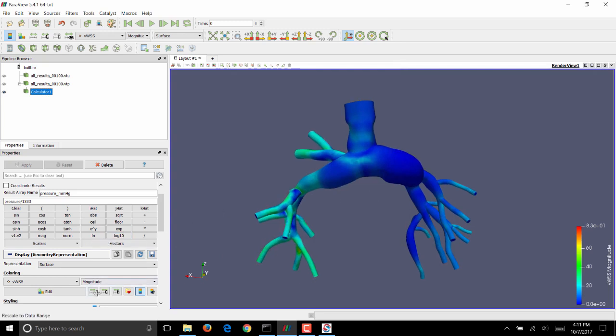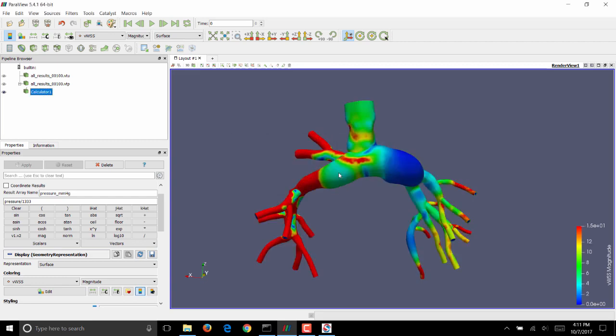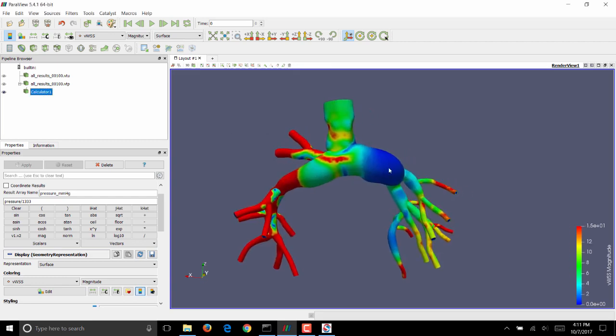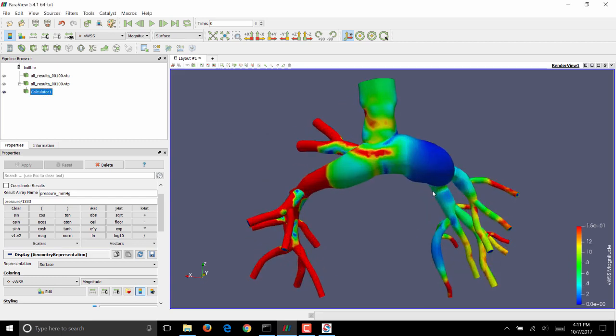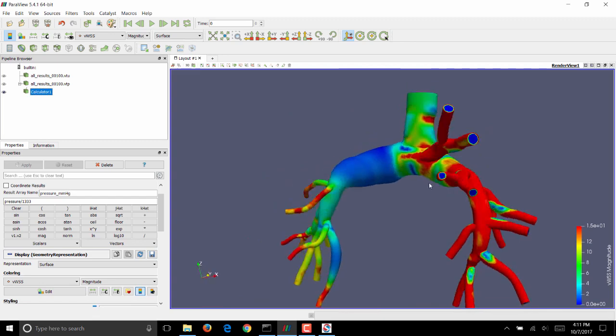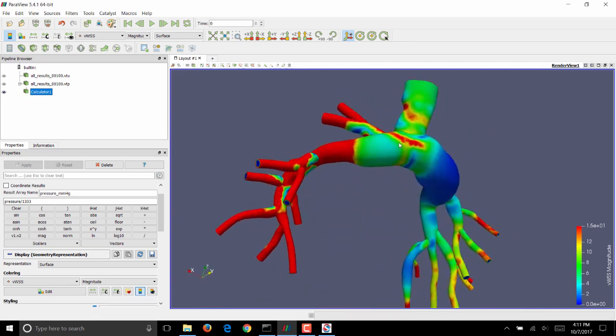You want these numbers to be within clinically relevant range. So we'll rescale it to a custom range and display all values that are between 0 to 15 dyn per centimeter squared. Click on Rescale, and you should see a wall shear stress distribution that looks like this. See that the distribution is patchy, which means that there's probably a need for mesh refinement on this geometry.